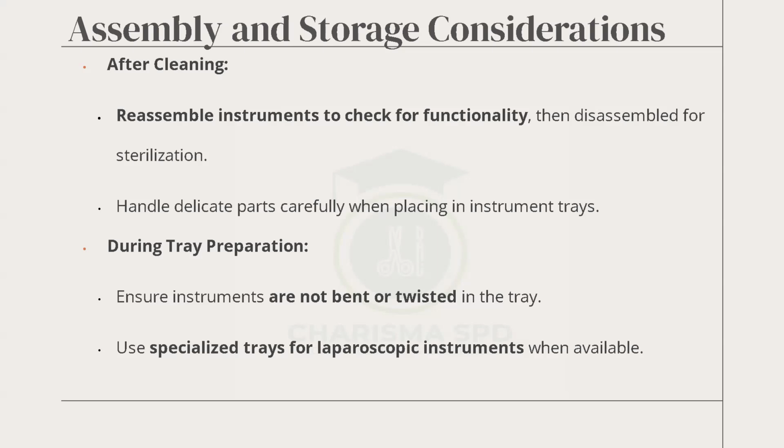And each of the handles has to go with a particular laparoscopic instrument. You don't just put any handle anyhow. You can get help from the count sheet. The count sheet will say use insulated handle. If it says use insulated handle and you go and use a metal handle, then it means that you are not able to read. One of the requirements of being hired is being able to read and write. If you cannot read and write, this job is not good for you because you could kill somebody.